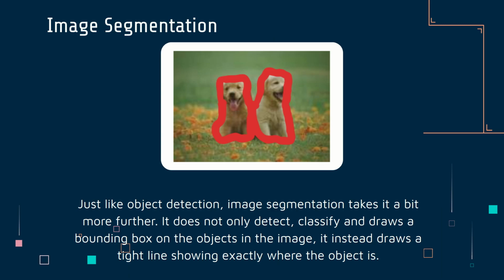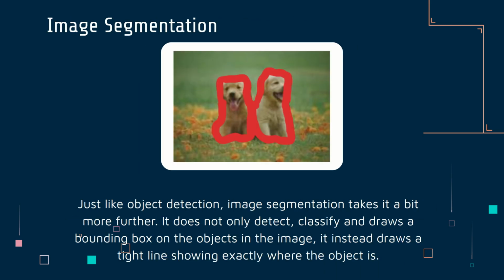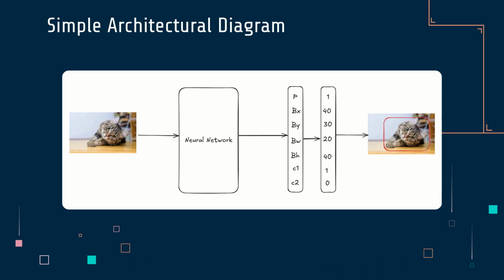So those are the very fundamental things within machine learning and object detection. So you're going to take all this and, in our case, you're going to be using object detection to detect which part of the human brain in an X-ray image has a brain tumor or not. Okay, you're going to be doing all this using LightlyTrain. So let's move on to understanding a simple architecture of how LightlyTrain works. So, sorry, not LightlyTrain, rather how a neural network works.